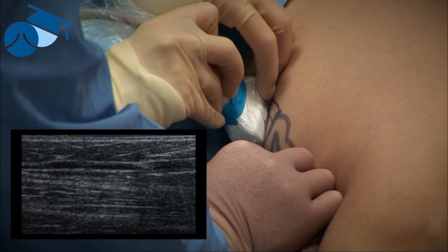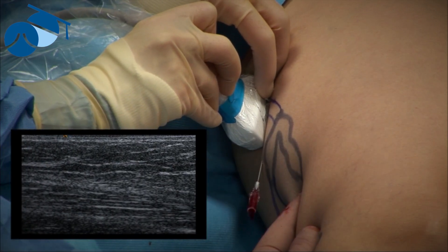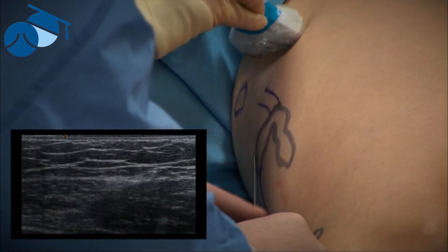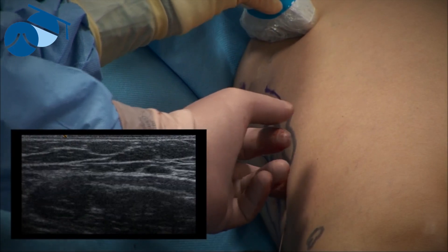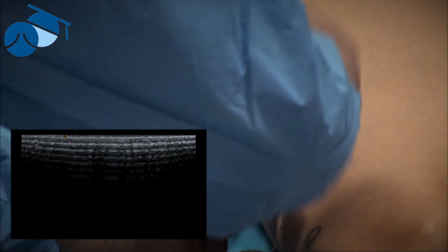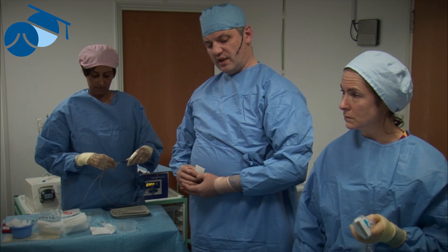Once we're in the vein we pass the wire up. We don't want to open another introducer sheath because that would be wasting money and resource. So we use some little steri-strips to hold that wire in place. Once we've treated the bottom end with radiofrequency, we can come back, cannulate the top down that wire, and treat the top part. Those are therefore our two access points for a complex great saphenous vein recurrence.